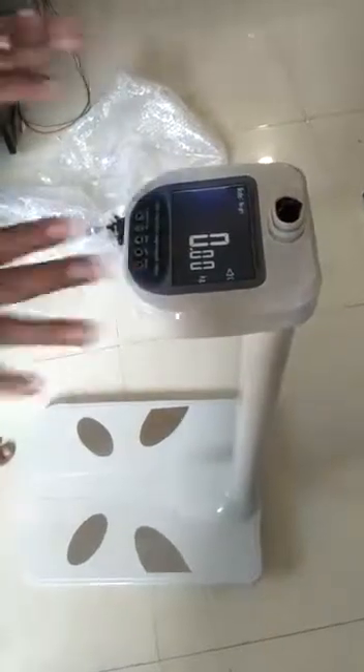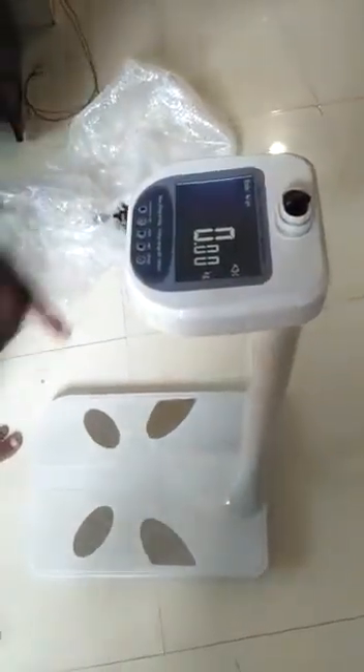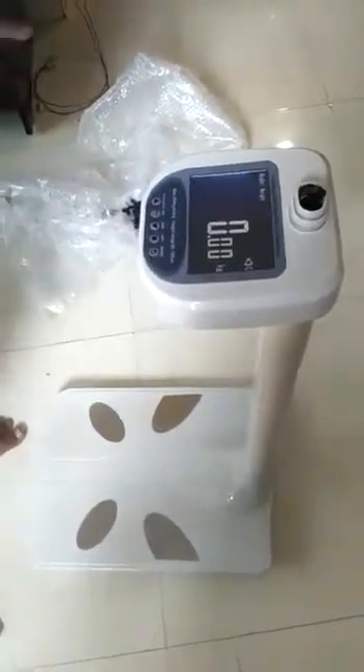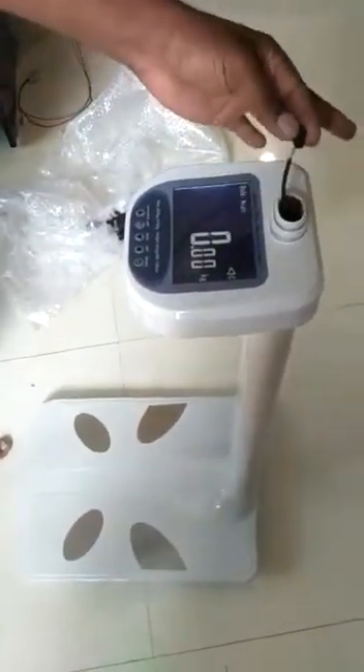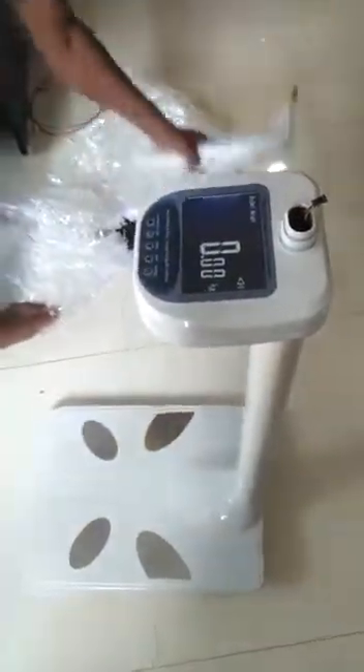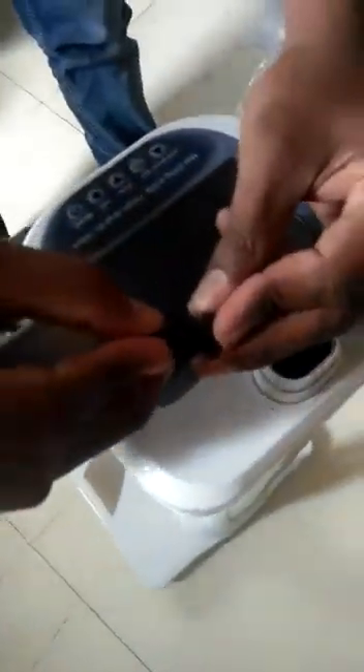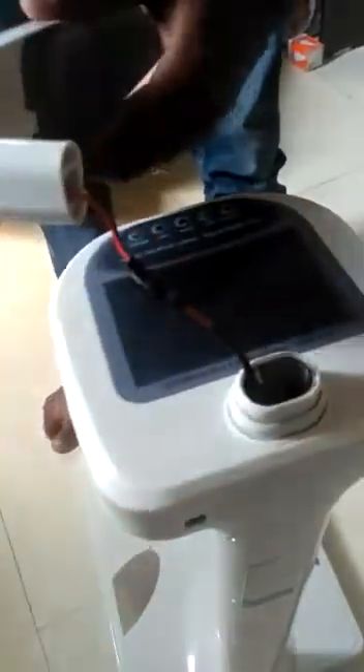Now your pole is ready. Your scale is ready to use, but right now it shows weight and height only. This is the ultrasonic height sensor — it will also have male and female connectors. We attach the male connector by opening this first port.